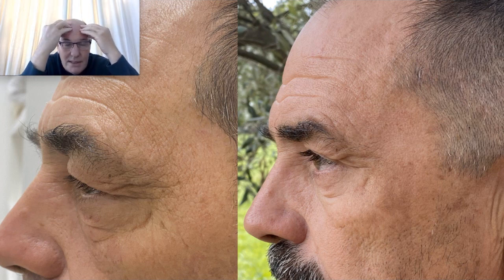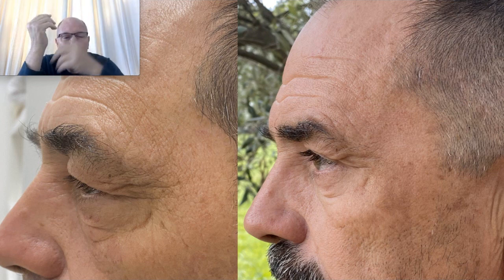Always this is a natural result, because I produce a reposition of the skin. I do not remove skin, and it all depends on the capacity of contraction of the skin of the frontal area. When the patient has spent a lot of time with golf or horse riding or whatever, the frontal area has a fibrosis and they don't contract like other patients, but we can see how they improved.